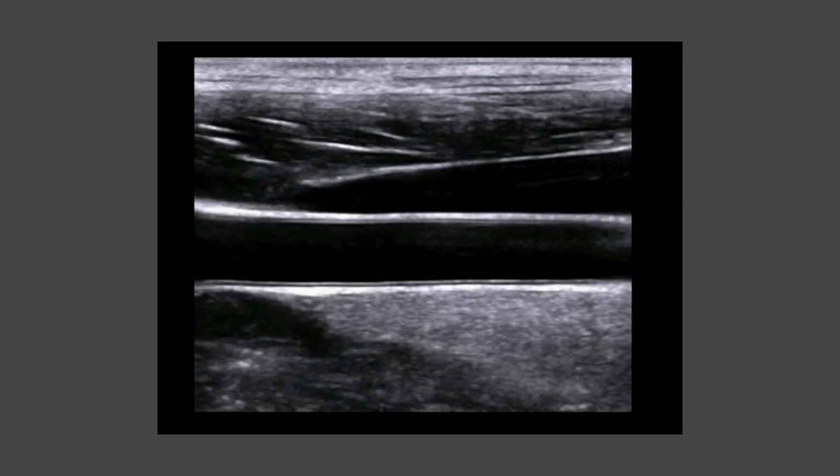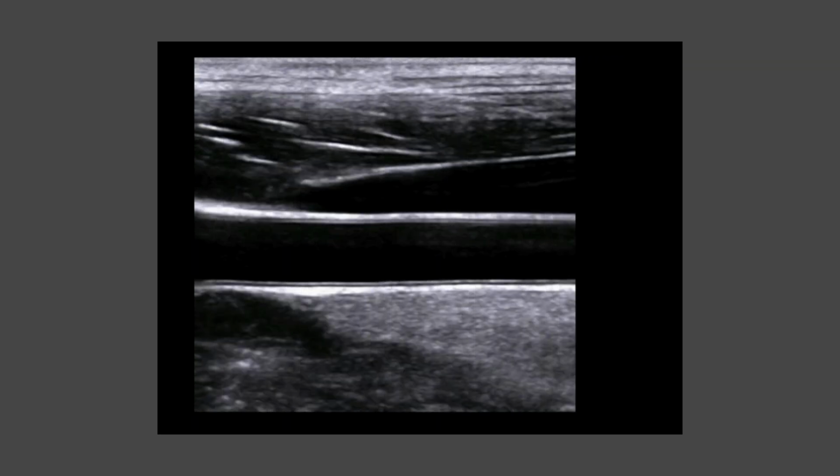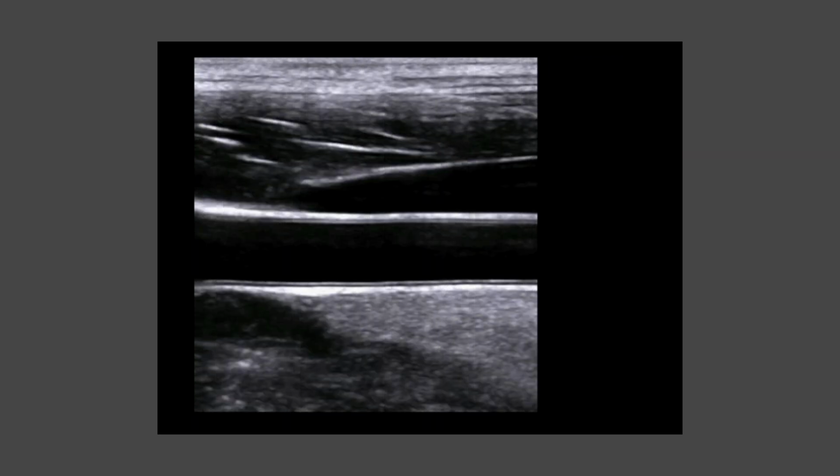Now we're looking at the image formation. So this is the echo information line by line, and here we see the final image itself being built up line by line until a complete image has been formed. That's then transferred to the display and the machine starts off building up the next image.